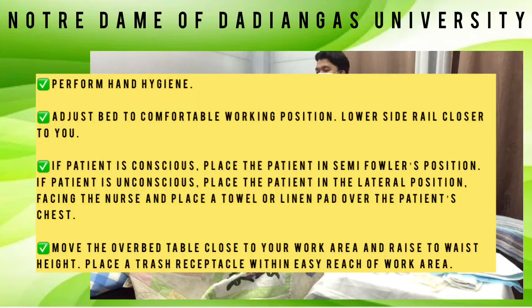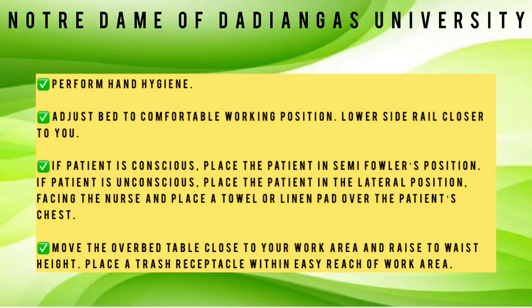Perform hand hygiene. Adjust the bed to a comfortable working position and lower the side rail closer to you. If the patient is conscious, place the patient in semi-Fowler's position. If the patient is unconscious, place the patient in the lateral position, facing the nurse, and place a towel or linen pad over the patient's chest.